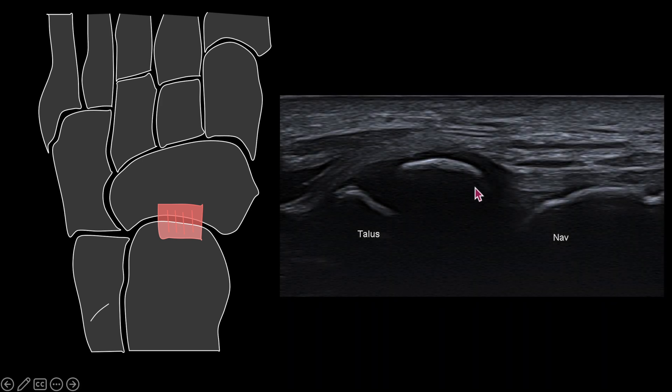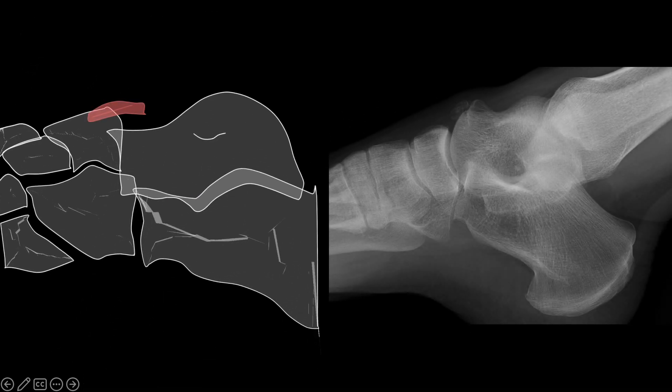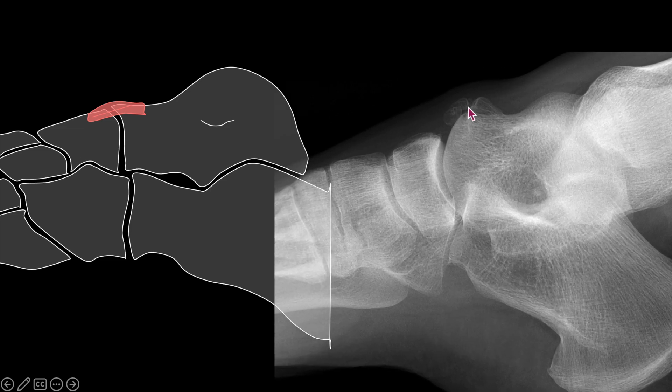Some pitfalls to be aware of include the os supra naviculare, an accessory ossicle not to be mistaken for an avulsion fracture. This is the x-ray correlate which shows an os supra naviculare.